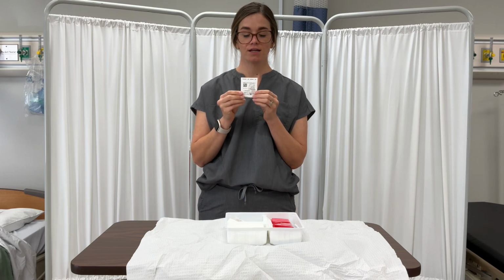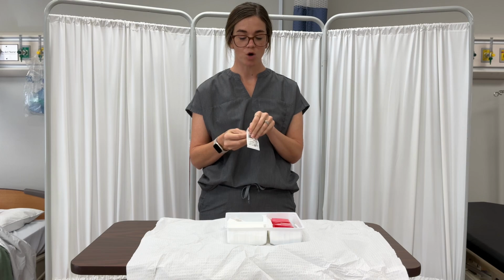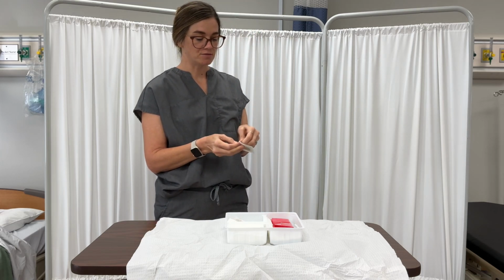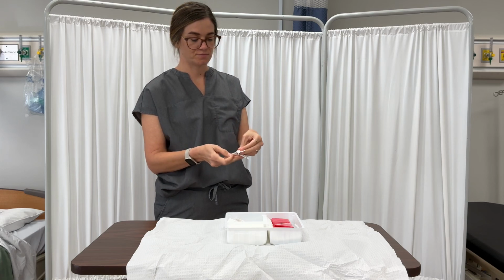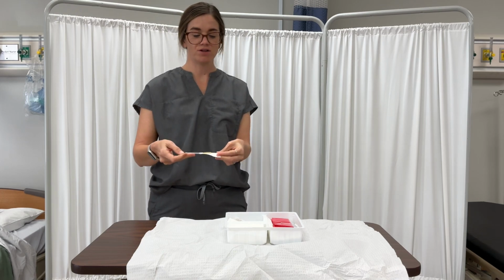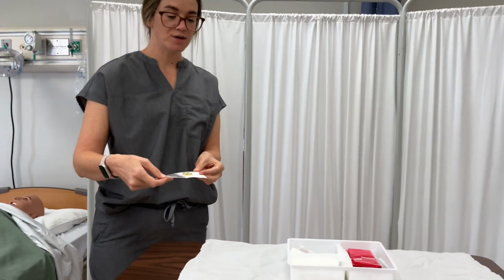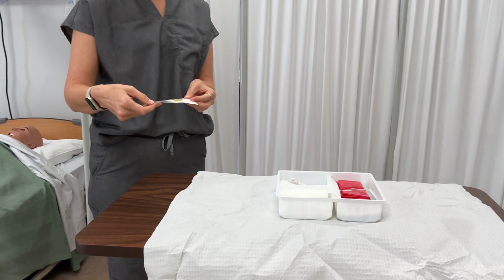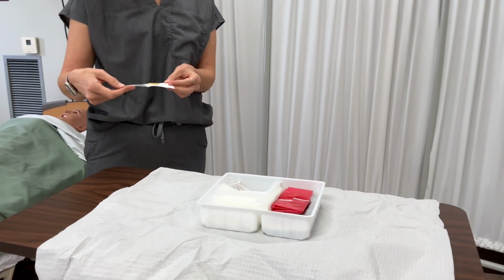The first thing I need to do is very carefully open up my package. As I'm opening this, I'm making sure that I'm keeping the item inside of that sterile area. Can you see pretty good? Okay, so I have it open. I'm going to come over here to the side and carefully toss this into my field. Now remember, we have a 1-inch border, so we have to get it inside of that sterile area.